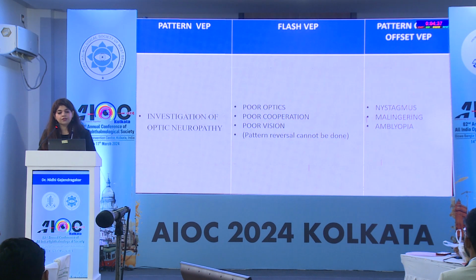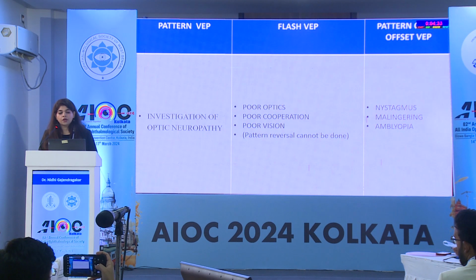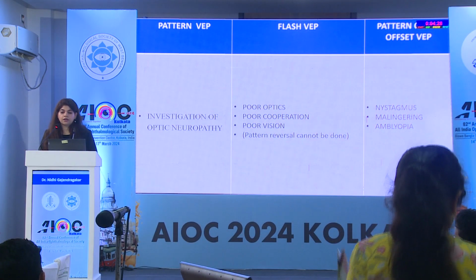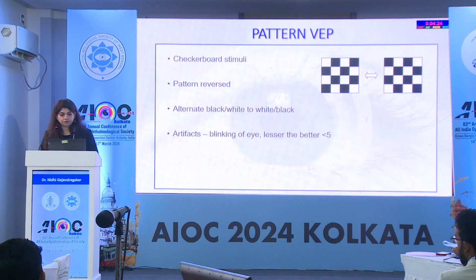Additionally, flash would be used when the optics are poor, cooperation is poor, or vision is poor, or when pattern reversal cannot be done. Pattern onset and offset is done in cases having nystagmus or malingering or amblyopia.